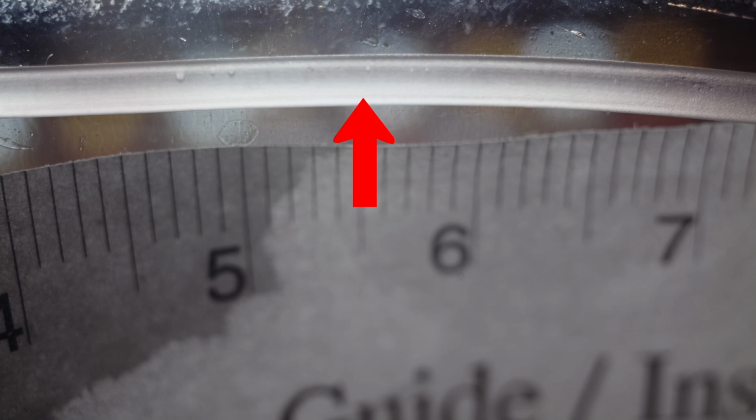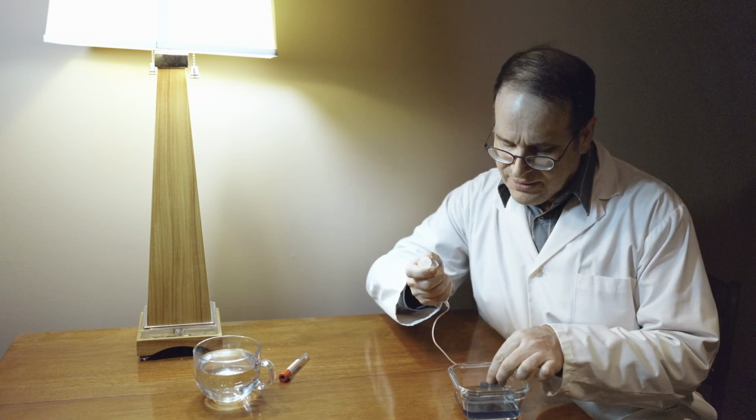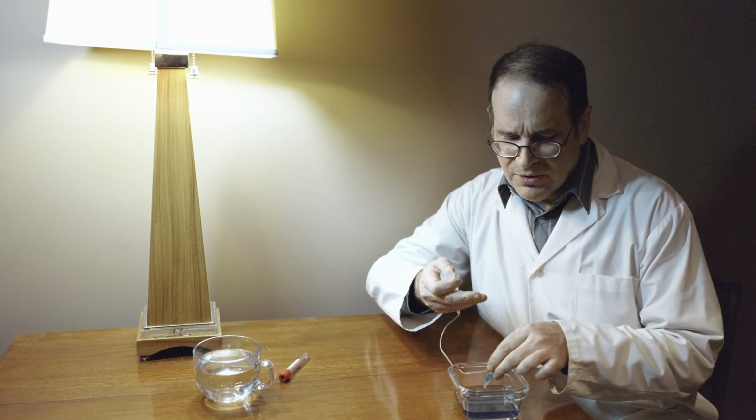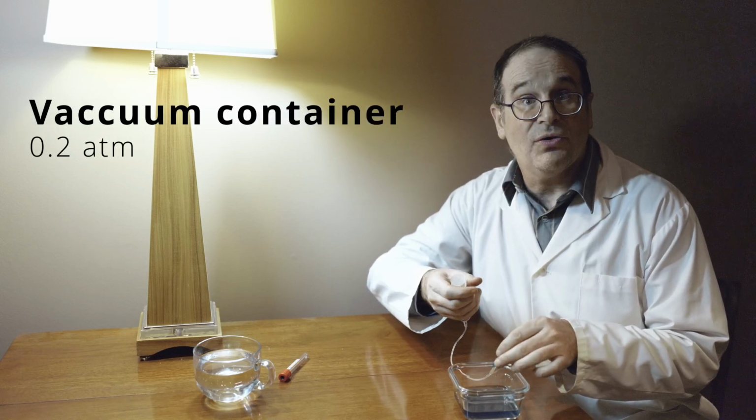So in our first experiment, we're just going to take some water and try and draw it up into our butterfly to see if we see the effect. So let's give this a shot. Oh, sure enough, we see exactly what's being described. We see some bubbles in there, they're moving along, and then when we try to apply another draw, we see the bubbles happening again. So, this is good news for us.